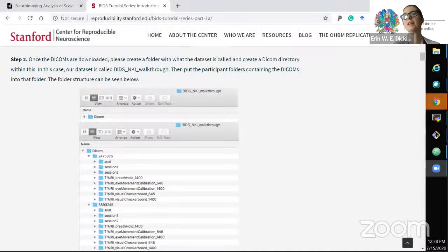you can use the JSON editor. If you download even the command line version of dcm2niix, you could point it to, sorry, we can't see your screen. If you are sharing the screen, you're supposed to be. I thought I was sharing. Let's see. Sorry, thank you. Wait, where is my cursor? Oh, I didn't push the last button. Okay, there it is. Sorry. Okay. So to go back, now you see my screen?